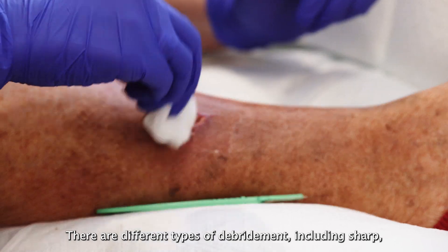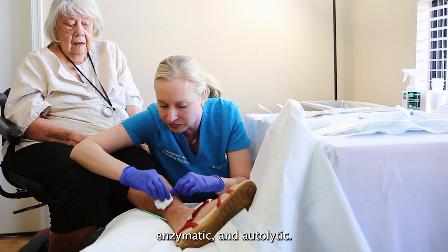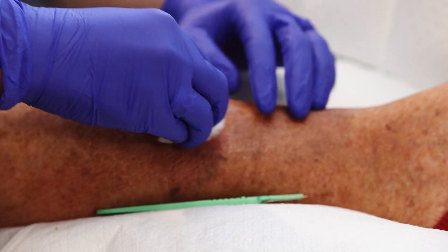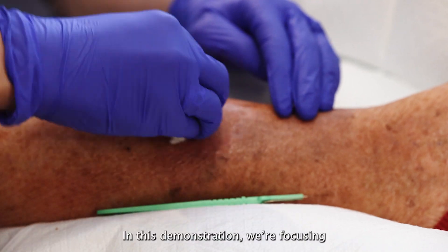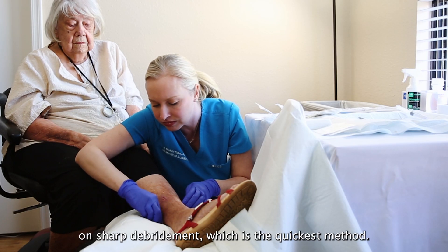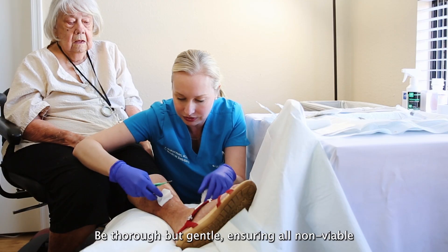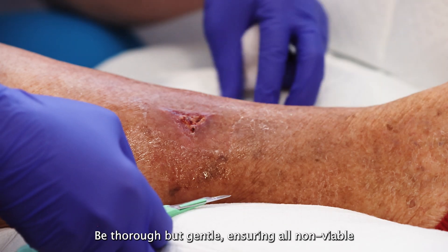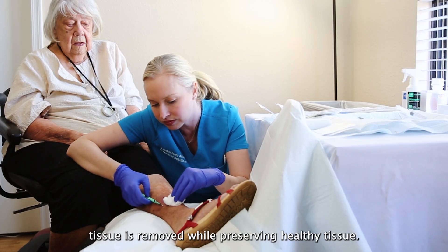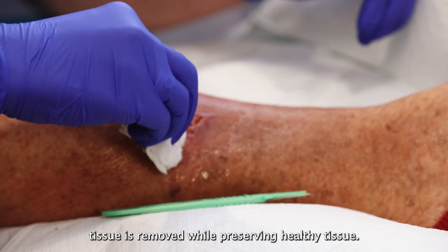There are different types of debridement, including sharp or mechanical, enzymatic, and autolytic. In this demonstration, we're focusing on sharp debridement, which is the quickest method. Be thorough but gentle, ensuring all non-viable tissue is removed while preserving healthy tissue.